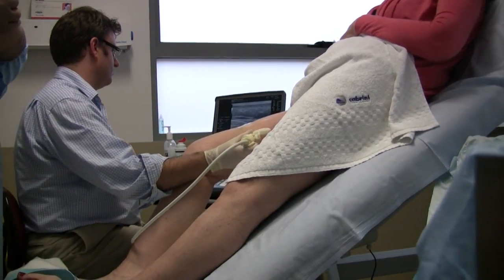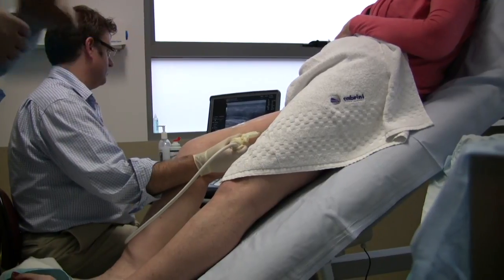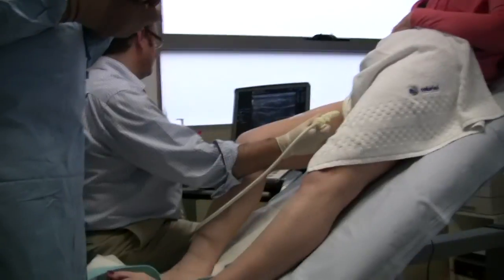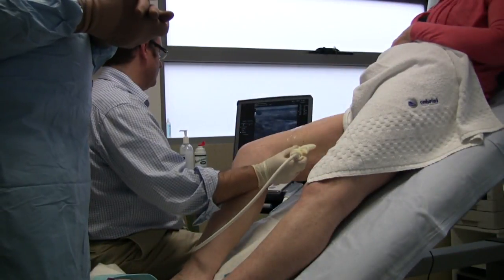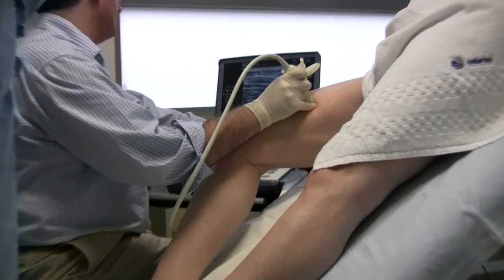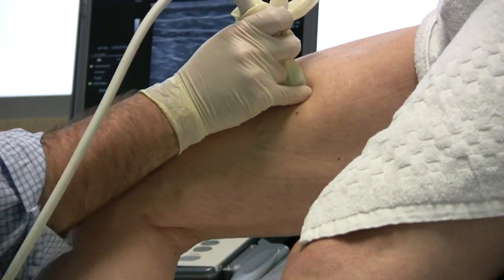The preliminary procedure involves mapping of the vein to be treated with ultrasound and outlining the best point to enter the vein with the appropriate access gear to commence the procedure.